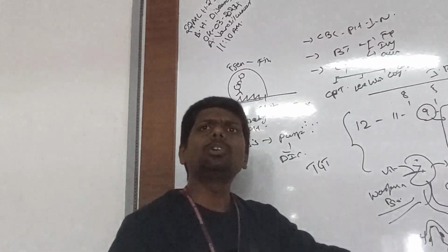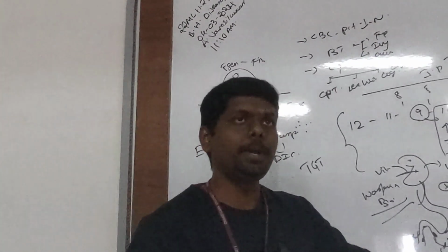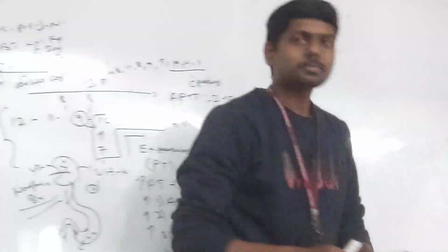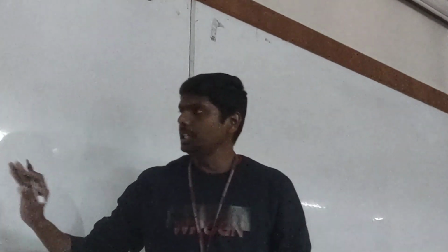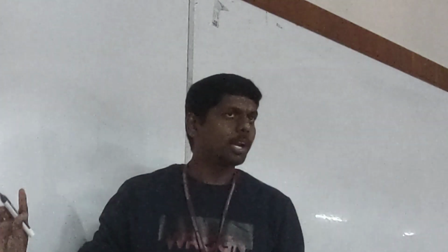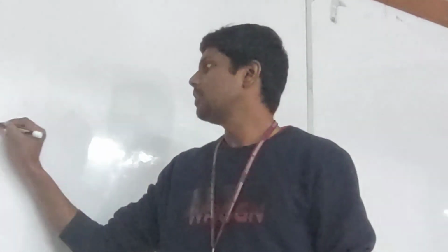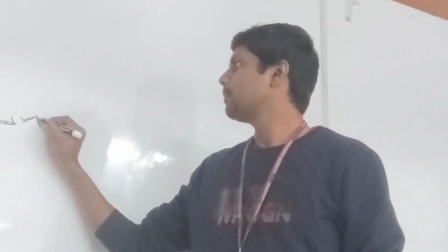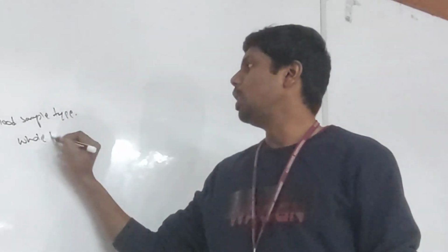Now I will discuss how to perform this test, how we will perform the prothrombin time test. Pay utmost attention, okay? For every coagulation study, what type of blood sample should we take? Blood sample type? Whole blood. Very good, whole blood you will take.